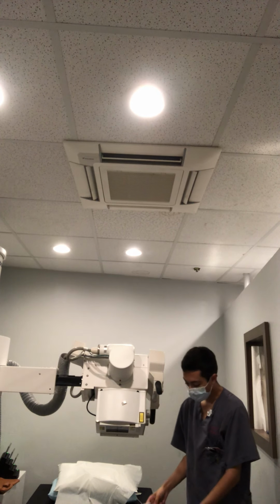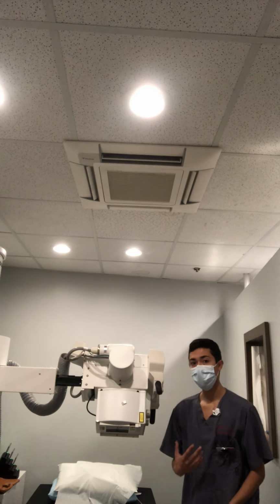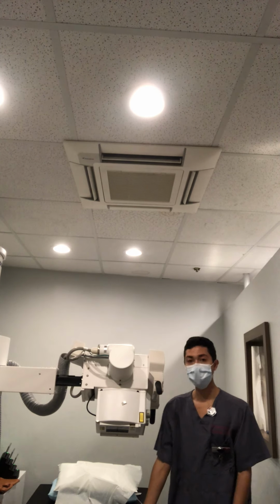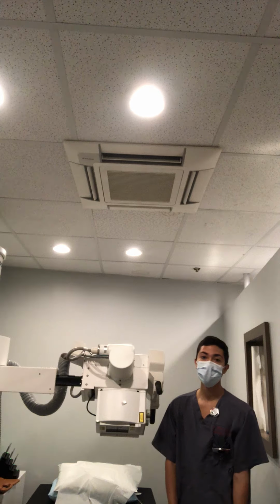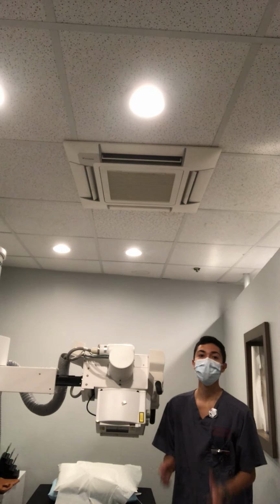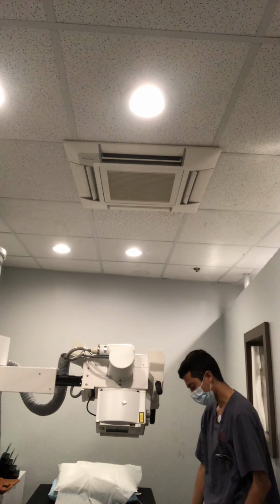Stuff like that. Respiration. We would ask them to hold their breath. Why? Because their mouth is closed, and also they're laying down. So it's not a projection where we need them to breathe in, breathe out. It's best if you hold their breath, because if they breathe in, you don't want the jaw or whatever moving, and just make sure they hold their breath. That's the most important thing.